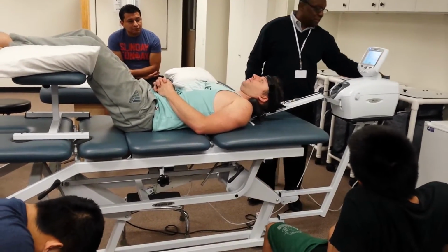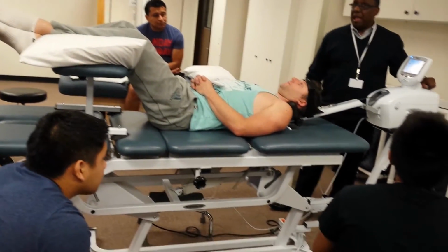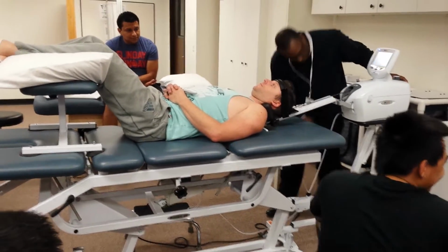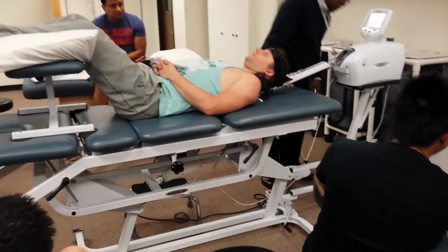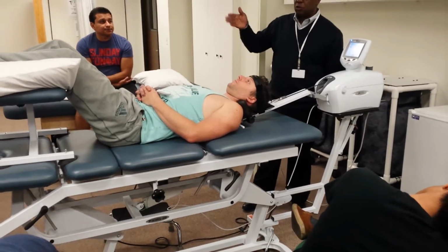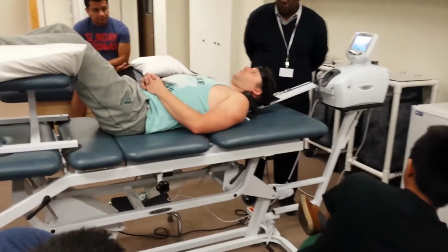But a couple things I noticed about this too that are just safety features. I noticed that the whole machine, this whole rig, is screwed onto this with this big knob back here. And if you get curious and you start messing around with that knob back here, don't. Because the whole machine is on that, right? It'll slip off. And it looks like this has another angle adjustment back here. Is that right? Yeah. There's another angle adjustment. So you can do this with this machine, not just this, but you can do this with it, which is kind of cool. All right, how are we doing so far?